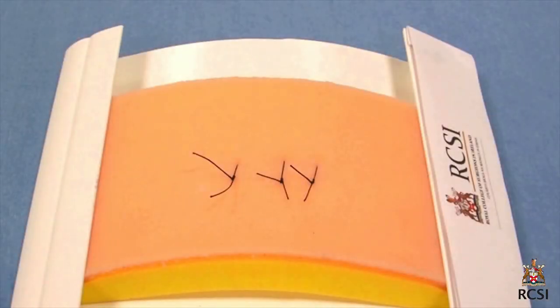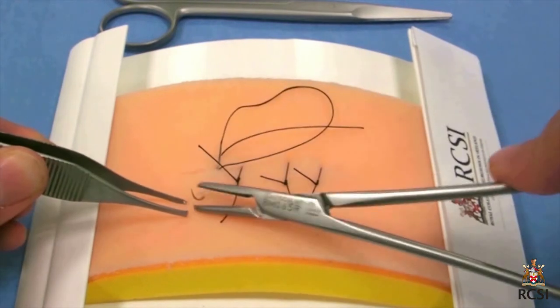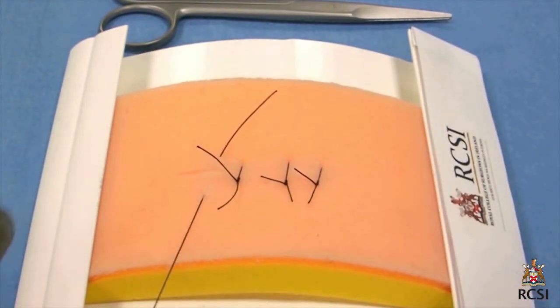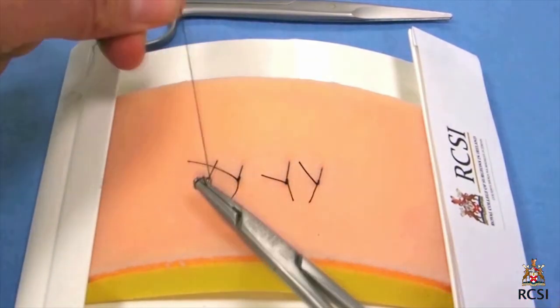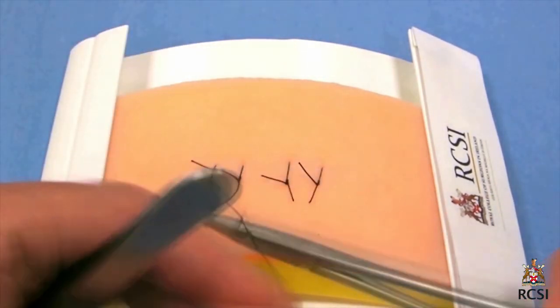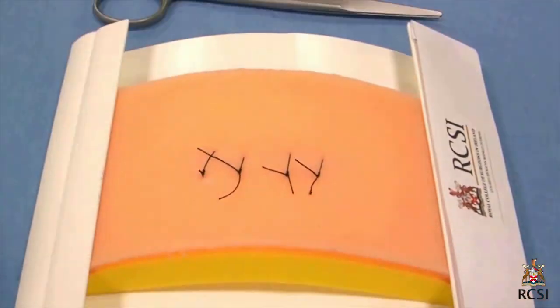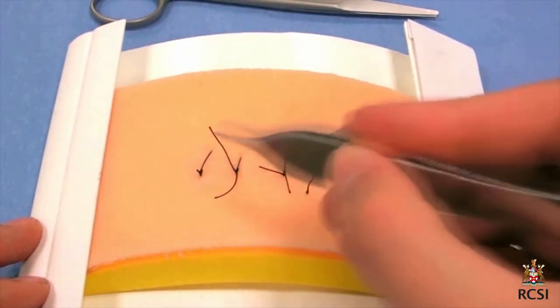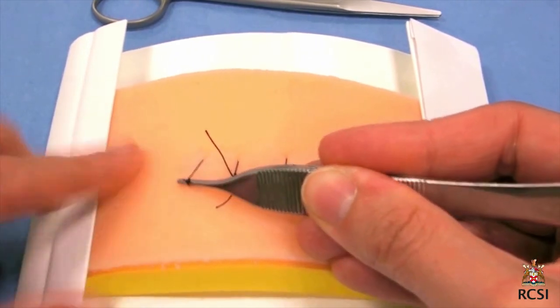The three sutures are equidistant apart, and the length of the suture is the same as the distance apart. All knots are to one side. Cut the sutures with the tip of your suture scissors. If cut too long, the ends will get caught in the next suture. If cut too short, the knot is less secure and may unravel.